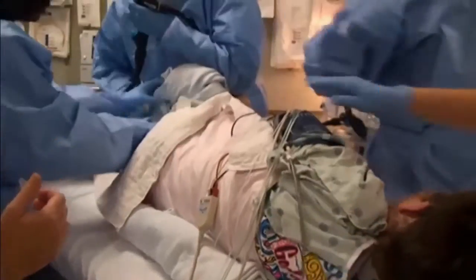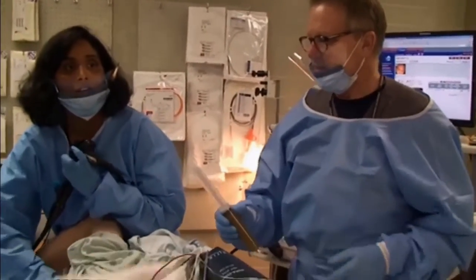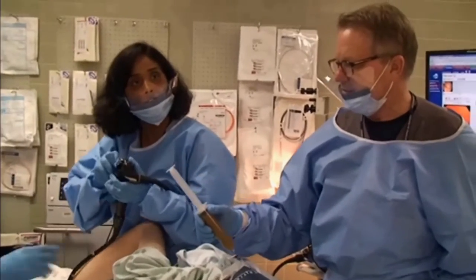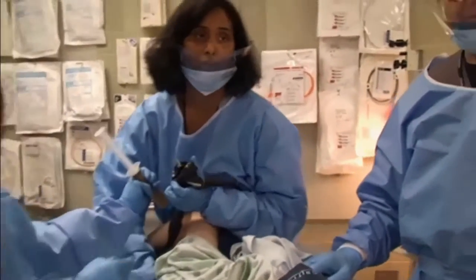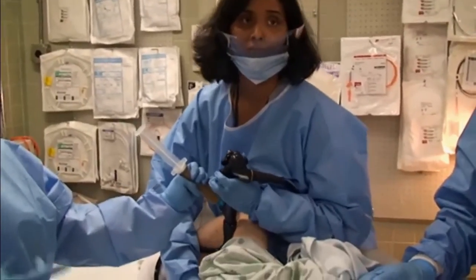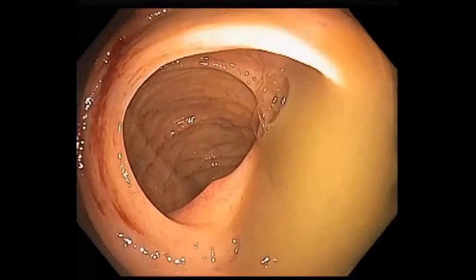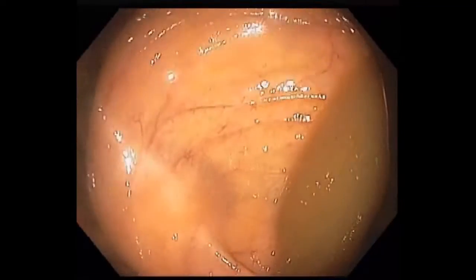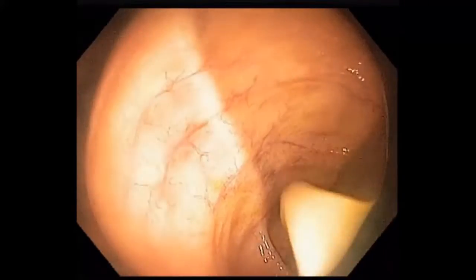Here we are doing the second case, where the specimen is being instilled via the colonoscope. Colonoscopy has proceeded to the point where we have reached the right colon. The patient is placed in the right side down position, so any fluid instilled will stay on the right side of the colon. The IC valve is entered, and the first 400 cc is placed in the terminal ileum. Here we are completing the installation of the fluid into the terminal ileum. The endoscope is then withdrawn quickly into the cecum. Here is a view of the cecum containing the fluid, with the patient still in the right side down position.